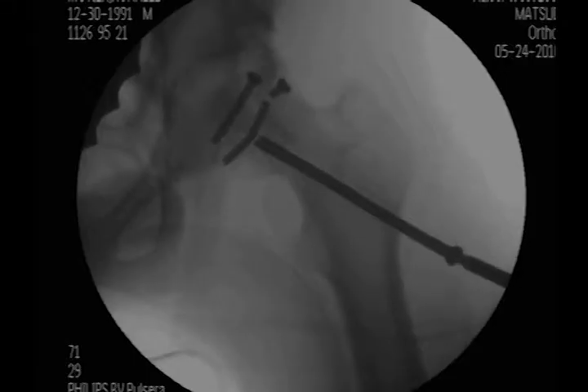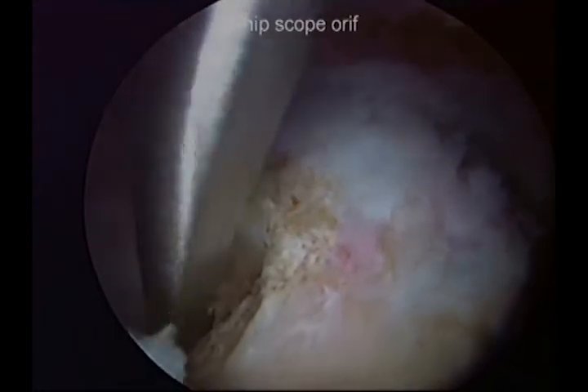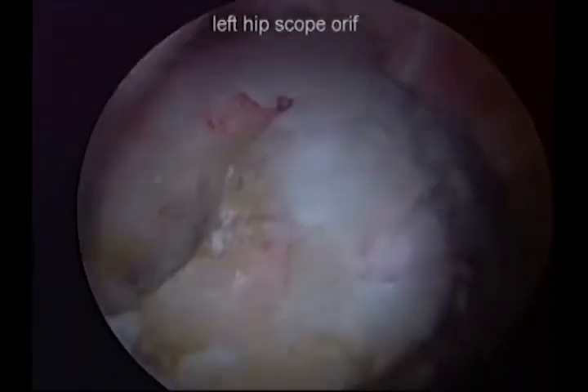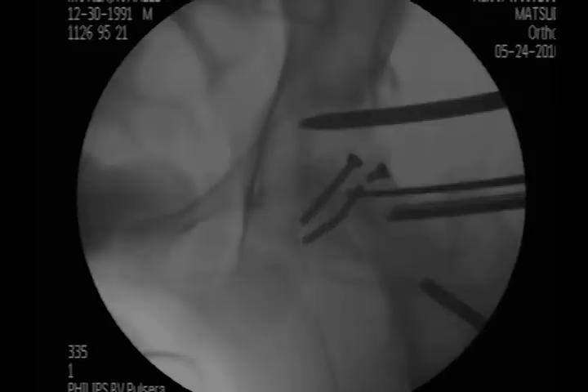We removed the lag screw and could not remove the smaller screws. We used a quarter-inch angled osteotome to locate the malunion fracture site and took this down using arthroscopic and fluoroscopic guidance.